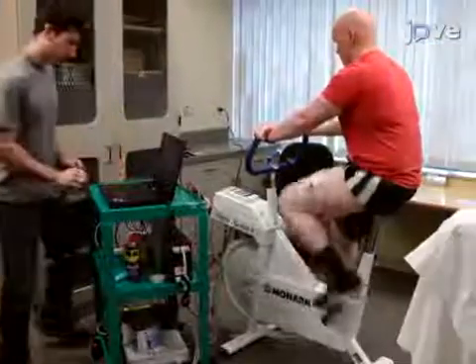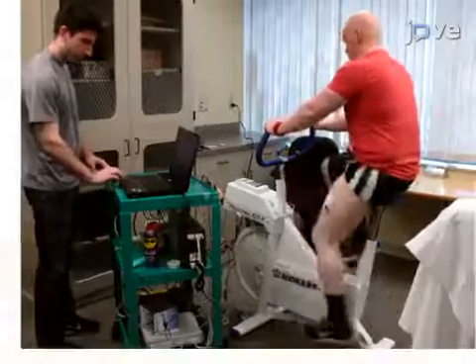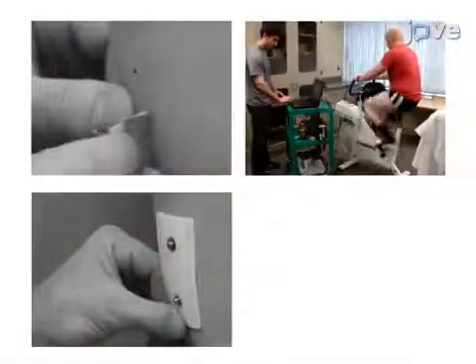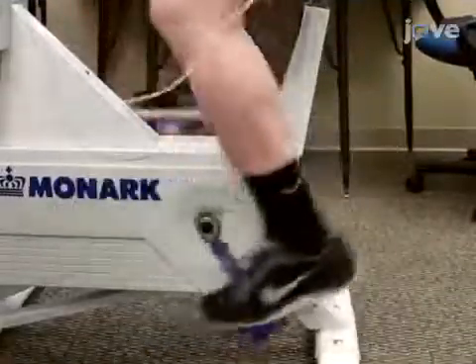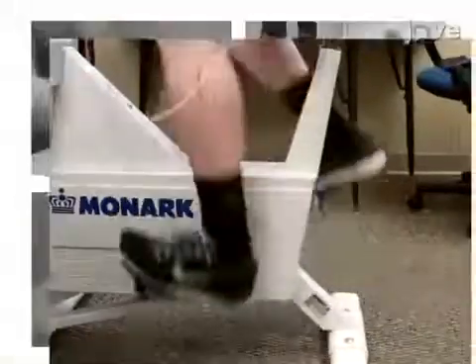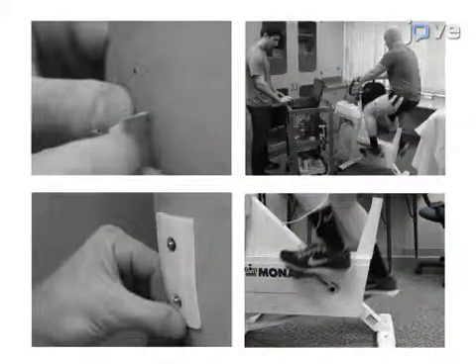Next, the EMG signal is checked to determine the signal-to-noise ratio and improve electrode placement if necessary. The final step is to have the participant perform an incremental cycle ergometry test to voluntary exhaustion.